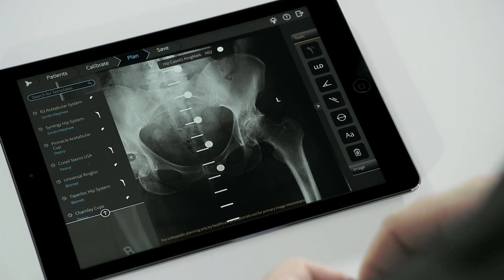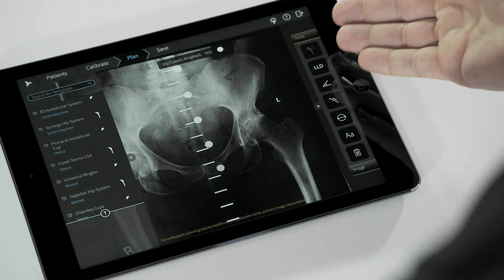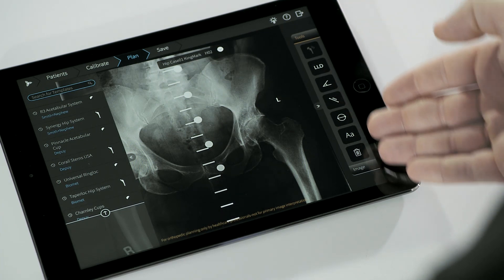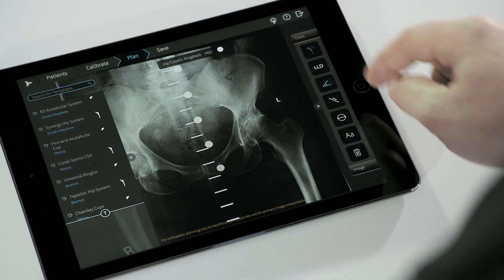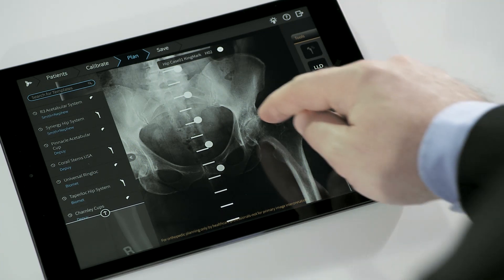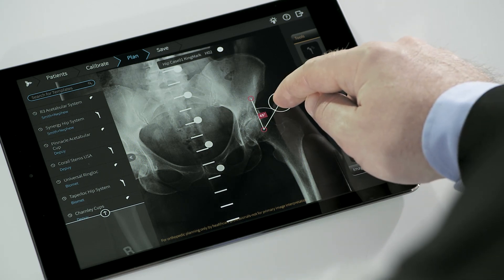Now the image is processed and ready for planning. Under the Plan tab, a selection of measurement tools is available including ruler, circle, angle, and text annotation.